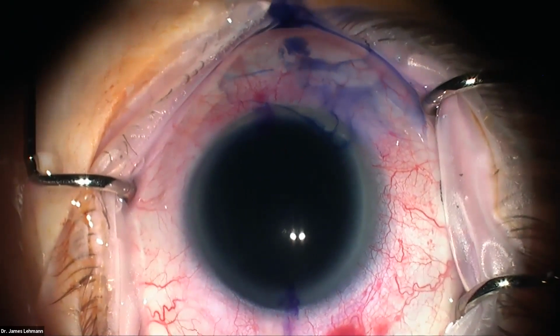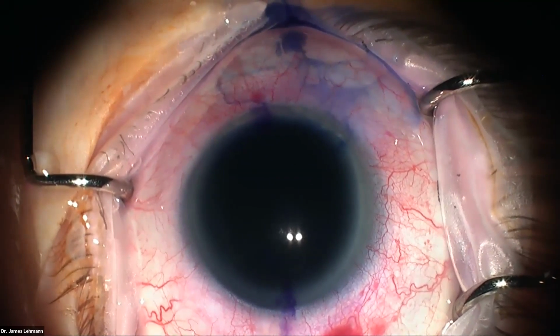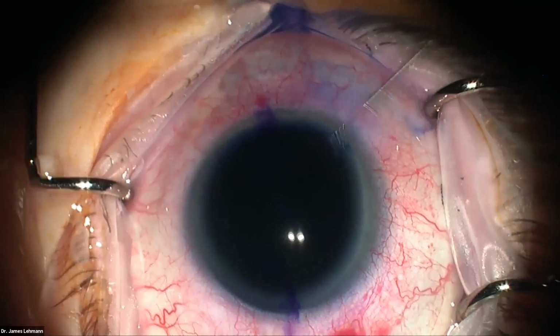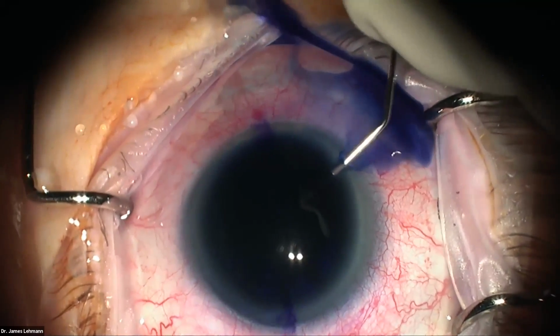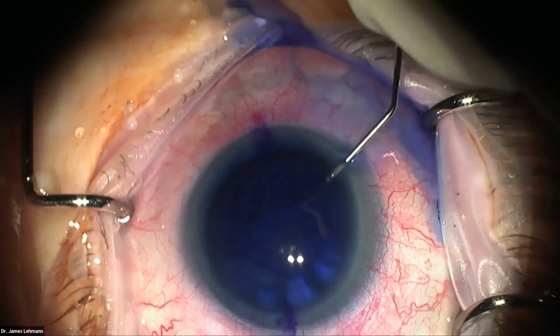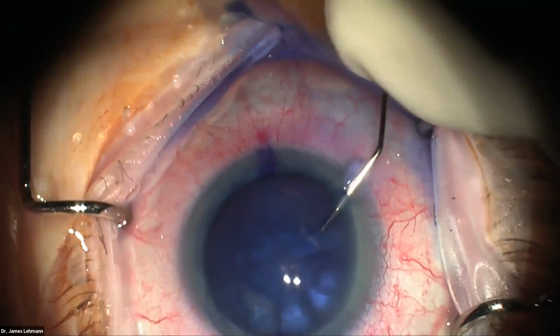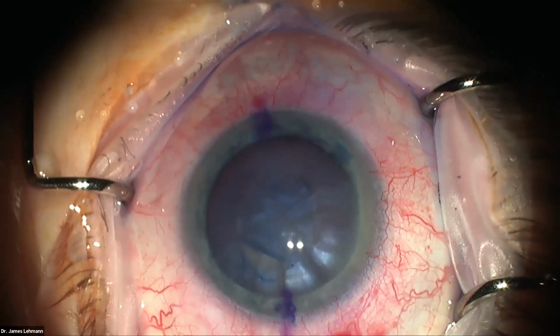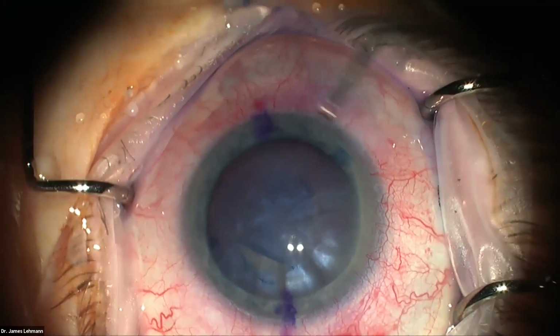I'm putting VisionBlue in here just so you guys can visualize that it's a complete capsulotomy, and it also helps to maintain your orientation during the phaco. So I'm just rinsing it out here, and we can see some of the capsule stained there, and then I'm going to put in the viscoelastic, which is of course again a dispersive.